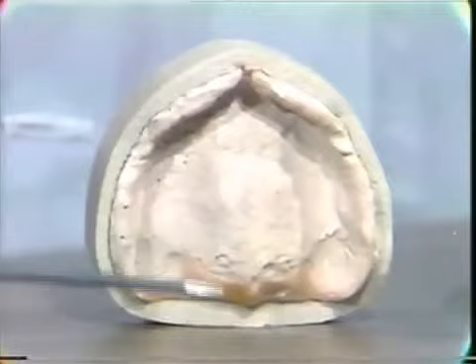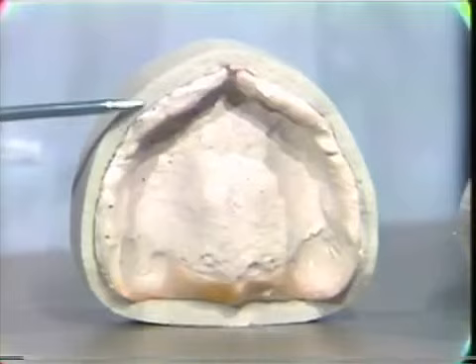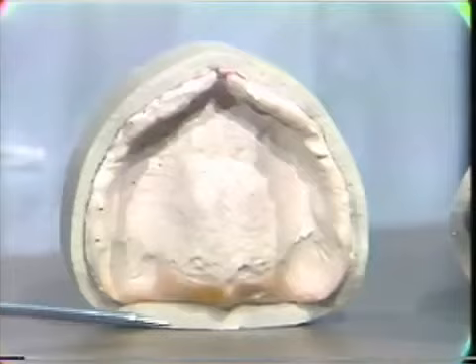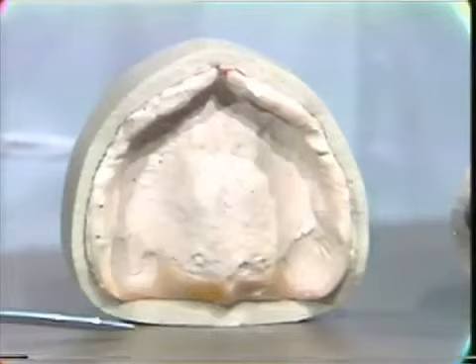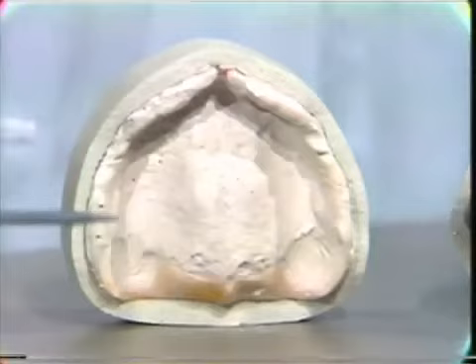I'd like to show you the maxillary impression. Again, you can see we have trimmed this to a width of about an eighth of an inch. If you're in doubt, leave this a little bit wider, because you can trim your cast on the model trimmer after it is poured. After you've done a few of these, you'll feel very comfortable trimming to the width you'd like. The only area that is often done wrong on the maxillary impression is posterior to the hamular notch and the posterior palatal seal area. In this area, do not trim to an eighth of an inch but at least a quarter of an inch for strength. Make very certain that you don't trim too close to the hamular notch as you come around the corner. You'll notice it does not look unlike a boxed impression with wax — the only difference being instead of wax, we have this impression plaster and pumice mixture.